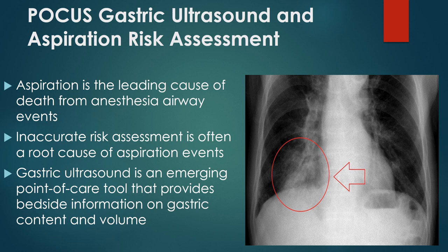Gastric ultrasound is an emerging point of care tool that provides bedside information on gastric volume, but also on gastric content based on some of the artifacts that you see with fluid versus solid foods.